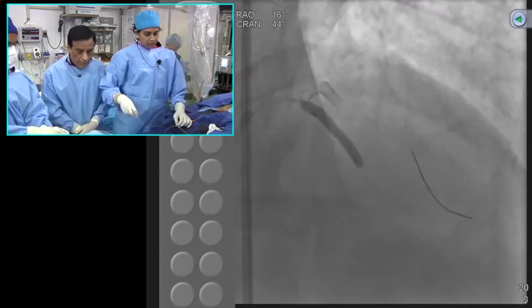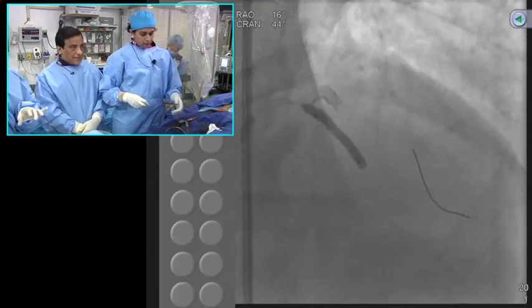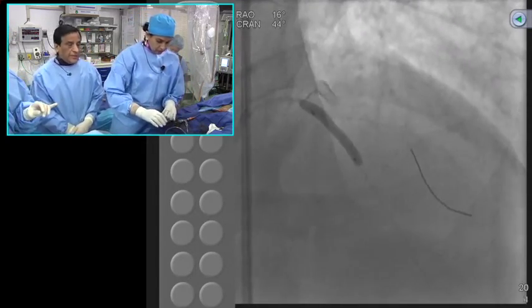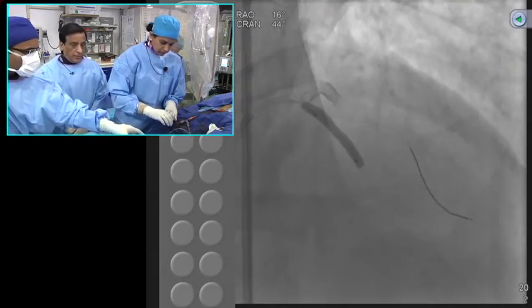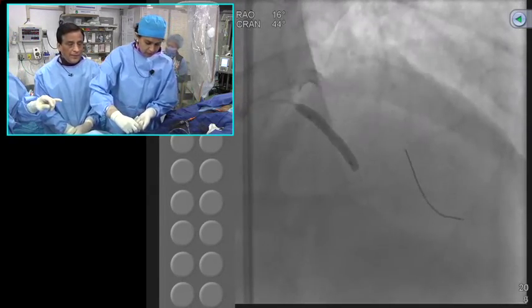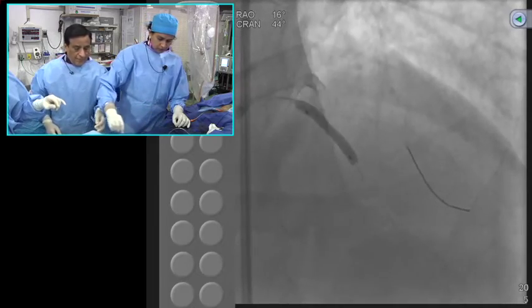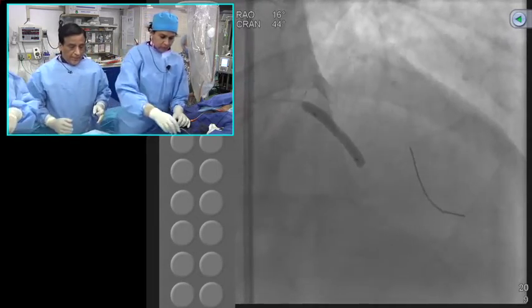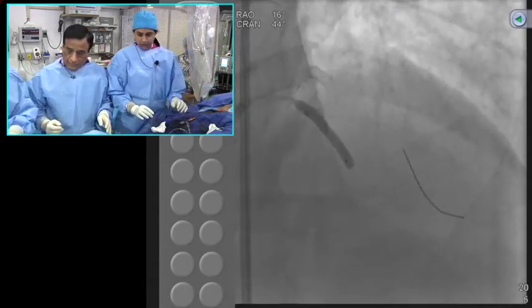So with that note, I would say there should be no question in my mind that, with this type of patient, you have done the PCI of the RCA at time 0, and that's okay. You evaluate your other two vessels at that time, and you may bring this patient back later because you didn't want to do all the multi-vessel PCI at that time. That's a reasonable approach. But the key is that FFR of the non-culprit vessel should be predictive.